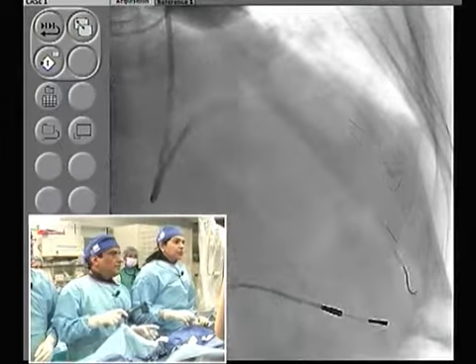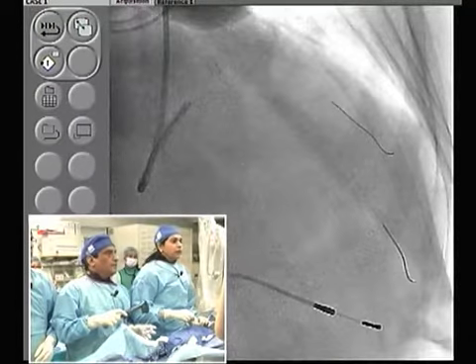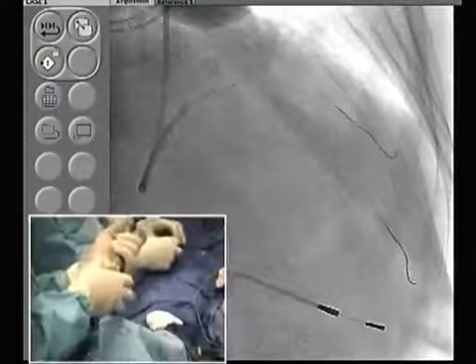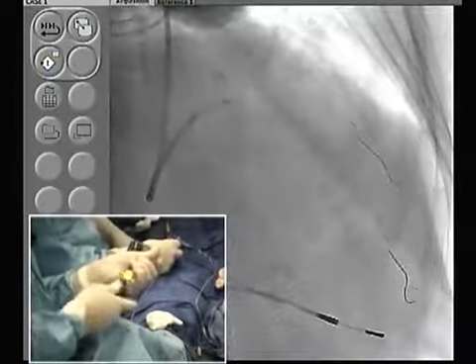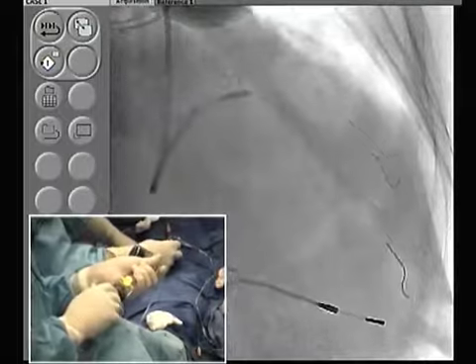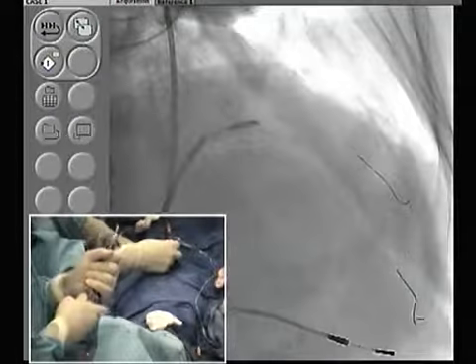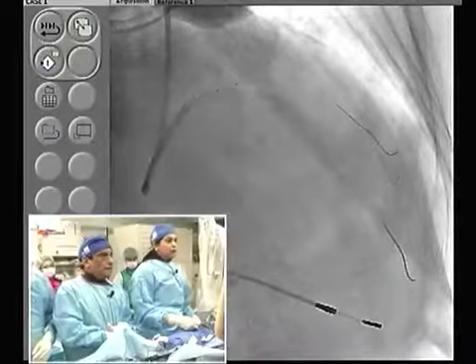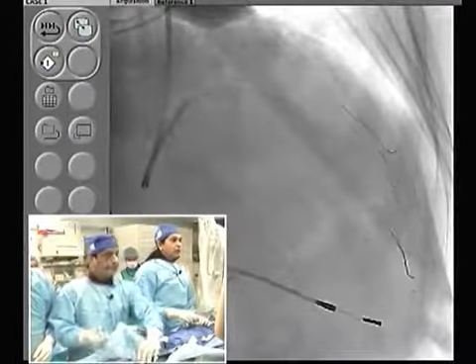Anu, what you can do is pull back. Same sizing strategy for a cutting balloon and the AngioSculpt? Actually, for the native vessel, you go a quarter size smaller. Got it. And if it is an in-stent restenosis, you can go a quarter or half size bigger. Like this one is a 2.75 diagonal. We have gone with a 2.5 cutting balloon.